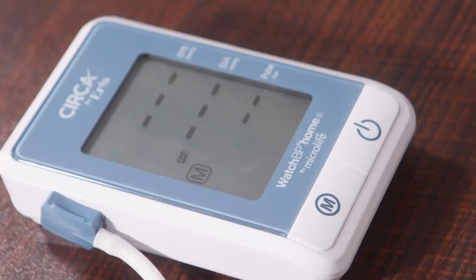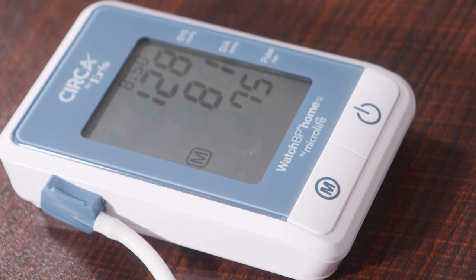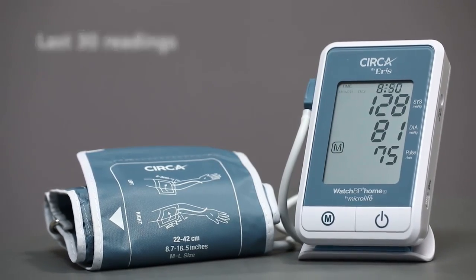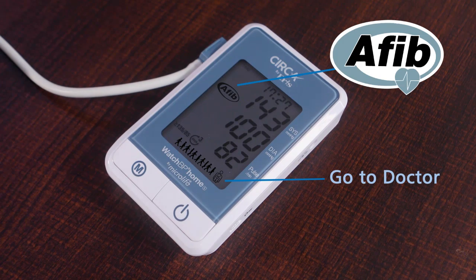To get your average blood pressure, press and hold the M button. The average of all readings will be displayed. This device has the capacity to store the last 30 readings. Update your doctor in case an AFib or Go To Doctor sign appears on the screen.